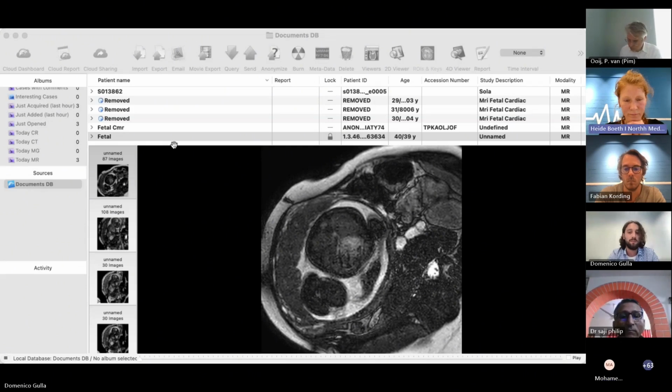No. We use the SmartSync, our product. It's Doppler gating ultrasound to synchronize the heartbeat of the fetus. Okay, it's not ECG. Okay. Yeah. Thank you, Domenico. Thank you, Mr. Sameh.